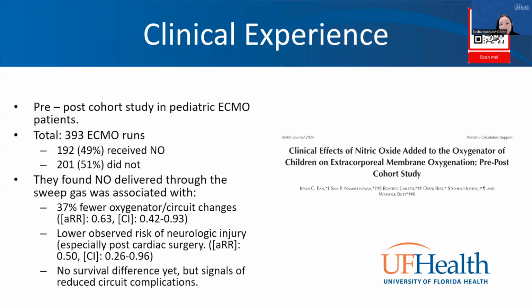In this other study, they wanted to evaluate the clinical effects of nitric oxide added to the oxygenator of children on ECMO, and this is a pre and post cohort study of pediatric patients as well. They had a total of 393 ECMO runs, of which 49% received nitric oxide in the circuit and 51% did not receive nitric oxide in the circuit.